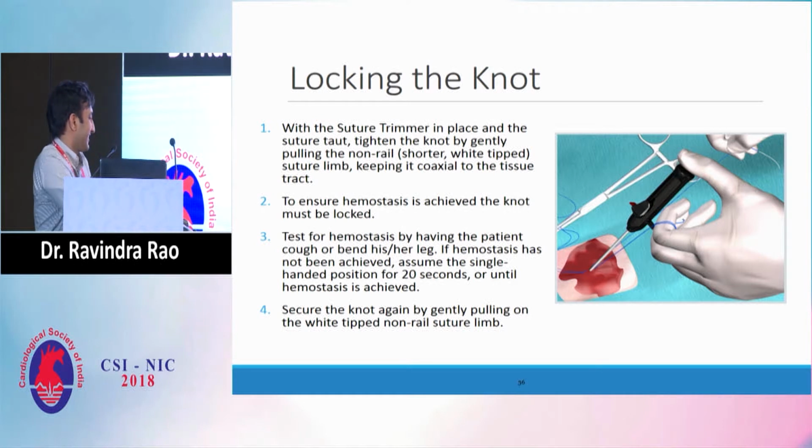I think with TAVR becoming more and more popular, and we are also using a lot of big sheaths in aneurysms, you should learn these pre-closure devices very well, and you should start doing them regularly, then only you can do it.